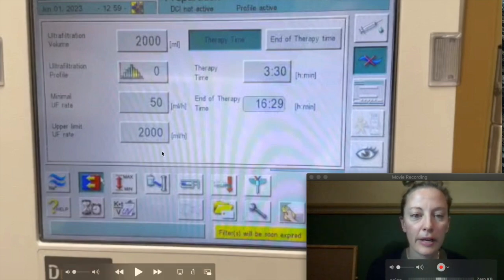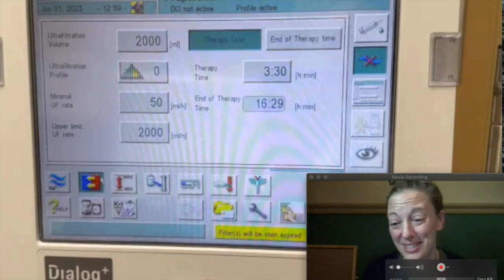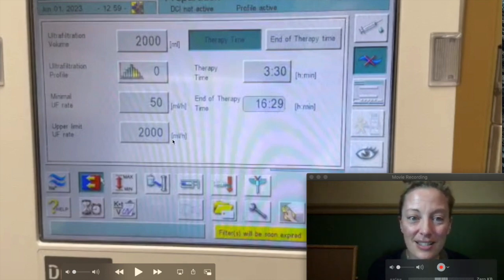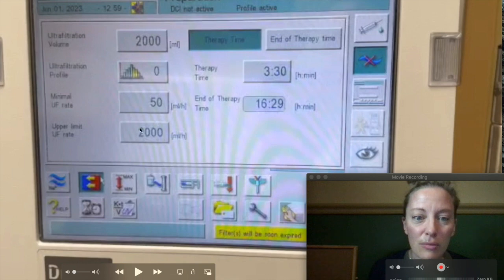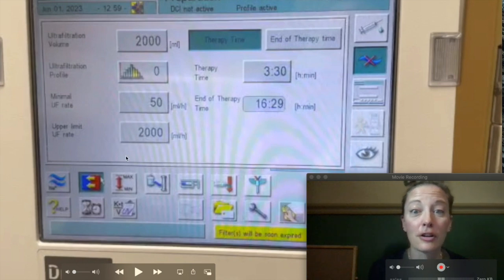Upper limit UF rate — this is a safety feature. The most that we can do: what if I put in 2000 but accidentally put an extra zero, and I'm trying to remove 20 liters in three and a half hours? That's dangerous — that is very unsafe. So this is a safety feature. If I do that, it's going to say 'Lindsay, this is too much fluid — can you check those numbers?' The most I can ever remove is 2000 mils per hour. I have had to increase this for one patient, one time, over my six years of dialysis nursing. So that generally never changes.